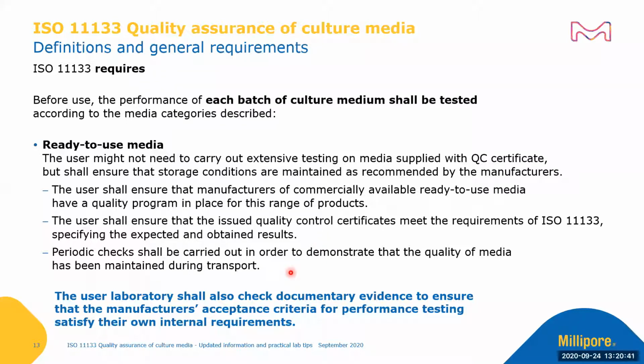Periodic checks shall be carried out in order to demonstrate that the quality of media has been maintained during the transport. The user laboratory shall also check documentary evidence to ensure that the manufacturer's acceptance criteria for performance testing satisfy their own internal requirements.